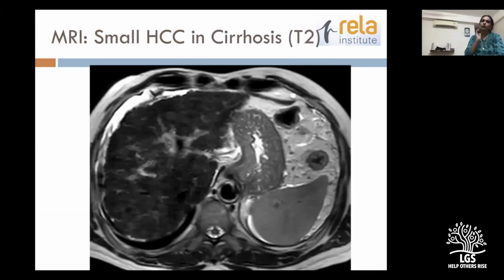Okay. Now, what happens if you can't give contrast? Many patients may either have hepatorenal syndrome or other associated chronic renal disease because of which we are unable to give contrast. In which case, plain MRI of the abdomen is done in our institute as a good alternative to a contrast CT. While the image resolution may not be as good as what we expect from a contrast CT, it gives us two main features that we need to know. One is the patency of the vessels, the portosystemic circulation pattern, the venous system, and are there any small HCC that may affect transplant.